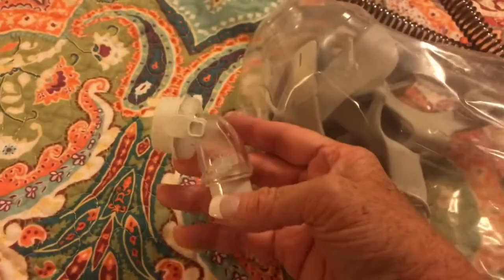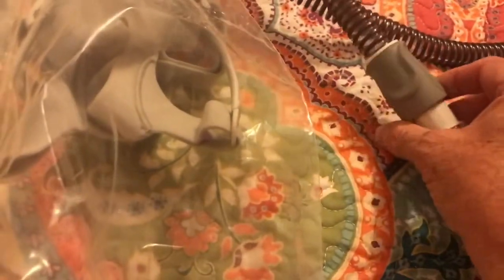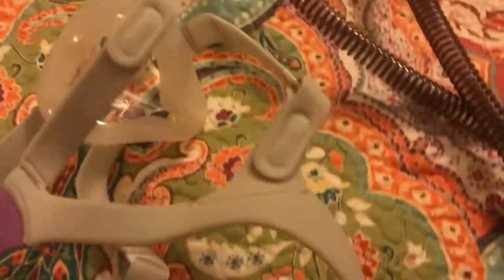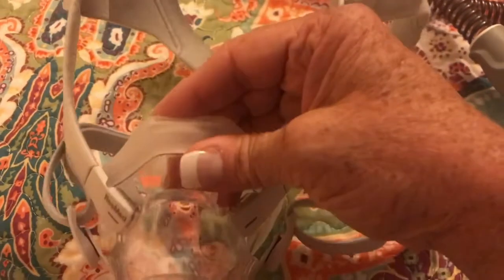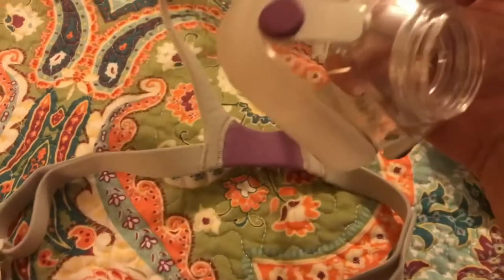This one has an elbow fitting that connects into my tube. One thing I like about it is it's purple — purple's my favorite color, so that's a positive. It's very soft with silicone cushioning around the face. It does come up the bridge of my nose, but not all the way up to my eyes. It has magnets like my other one did, so it unsnaps easily — it's easy to get out of.